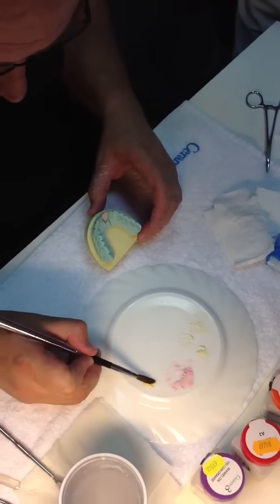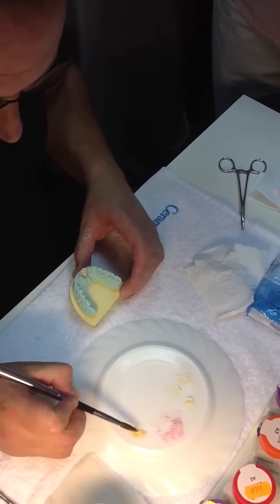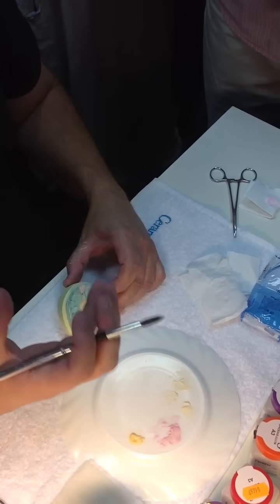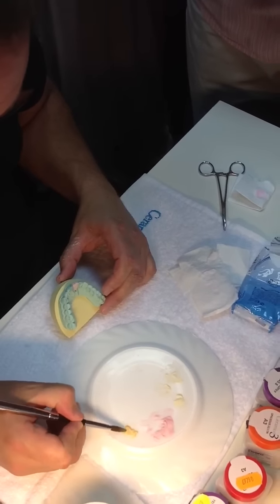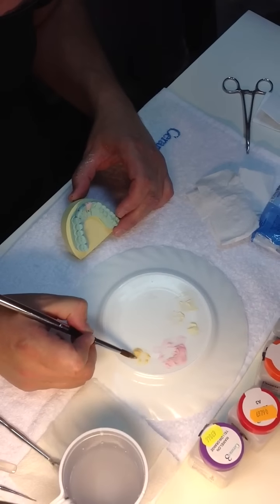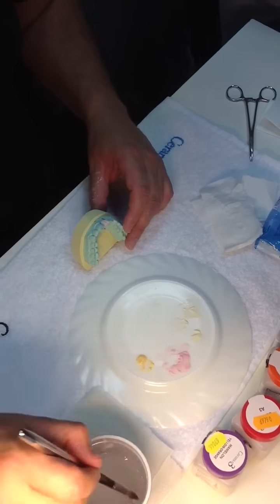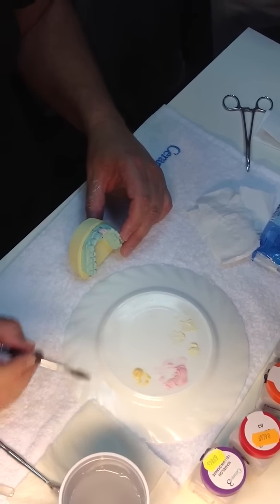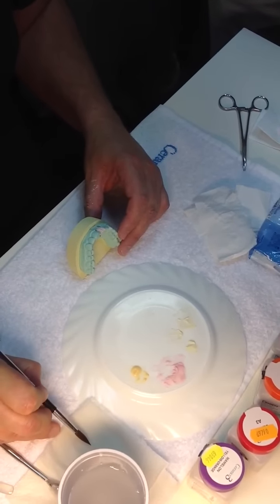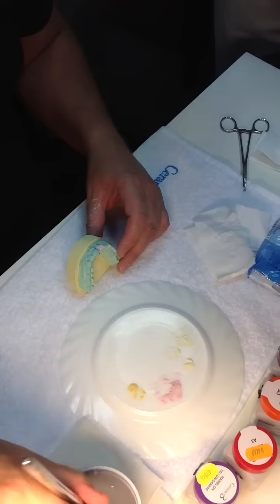And the mamelon effect, yellow-orange is quite an intense colour. The red-orange is very intense. So you need to be a little careful in how you use the mamelon effect. Generally, if you see mamelon in a tooth, it's quite subtle.